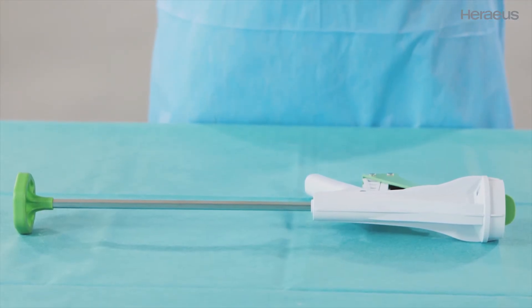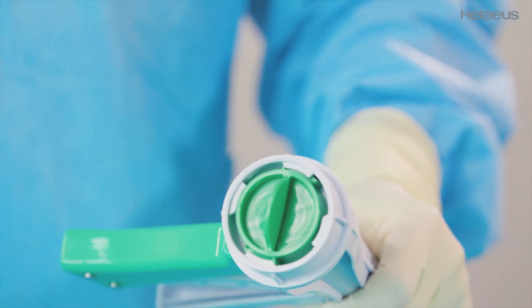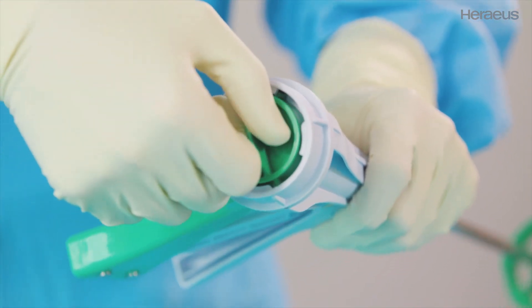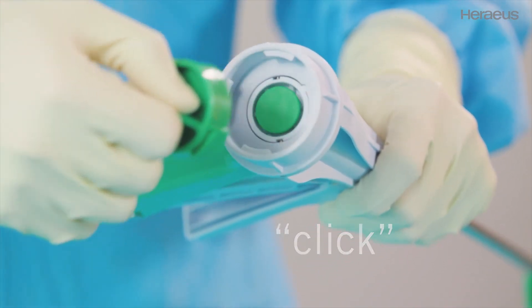Now, pick up the Palagon to attach the cartridge. Turn the locking cover counterclockwise until a click is heard. Then, release and remove.